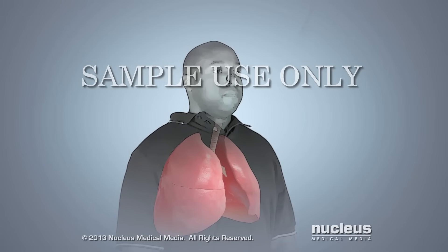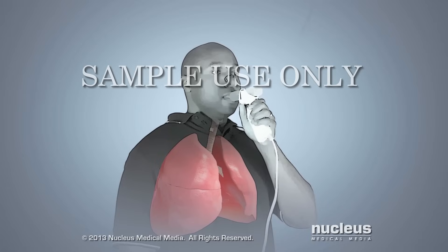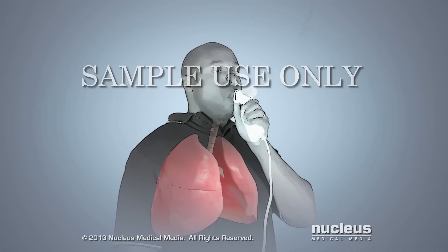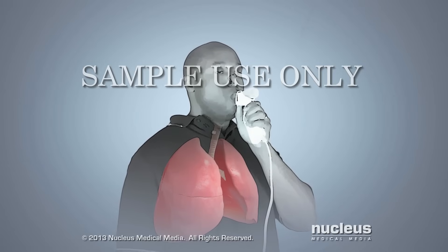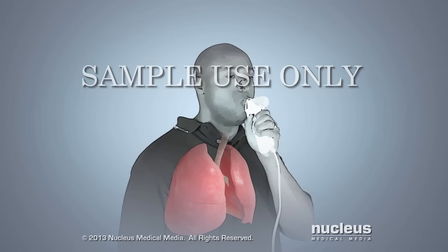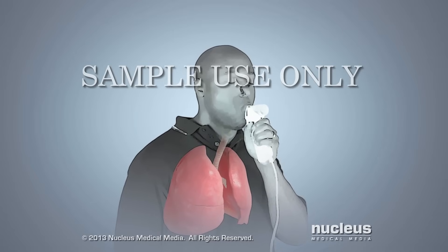You will place the spirometer's mouthpiece between your teeth and tightly seal your lips around it. Finally, you will blast the air out of your lungs as hard and as fast as you can, continuing to breathe out until your caregiver tells you to stop.